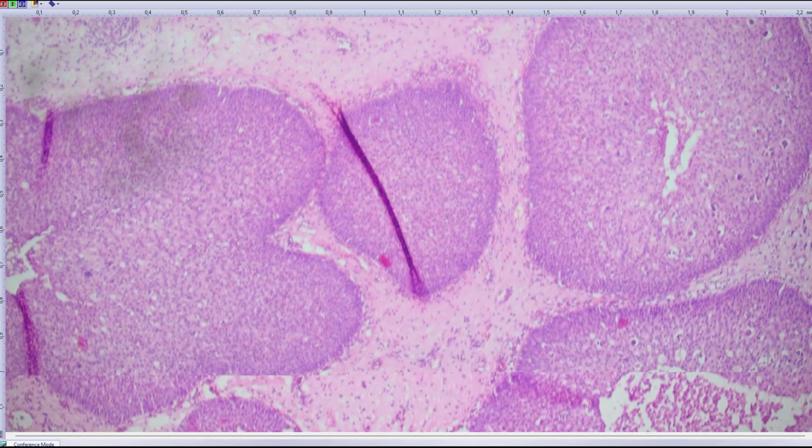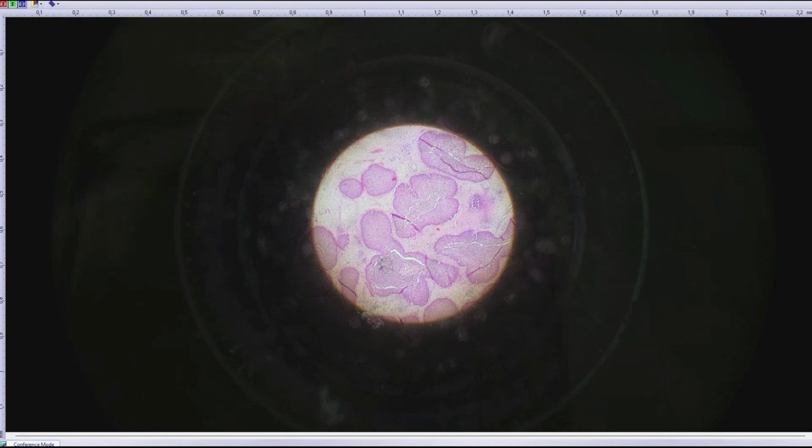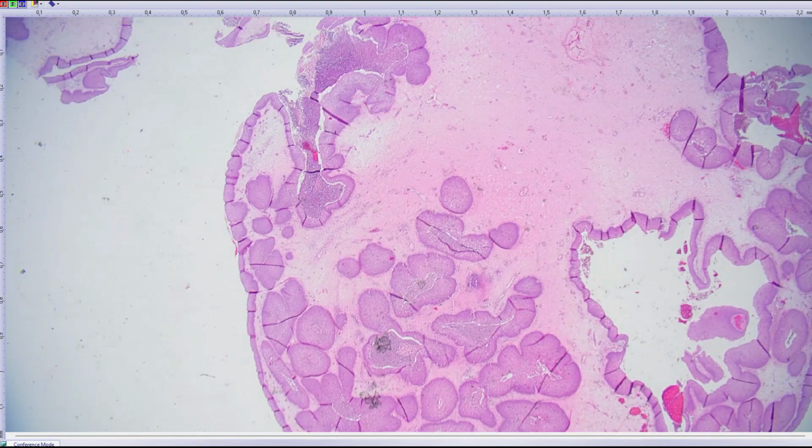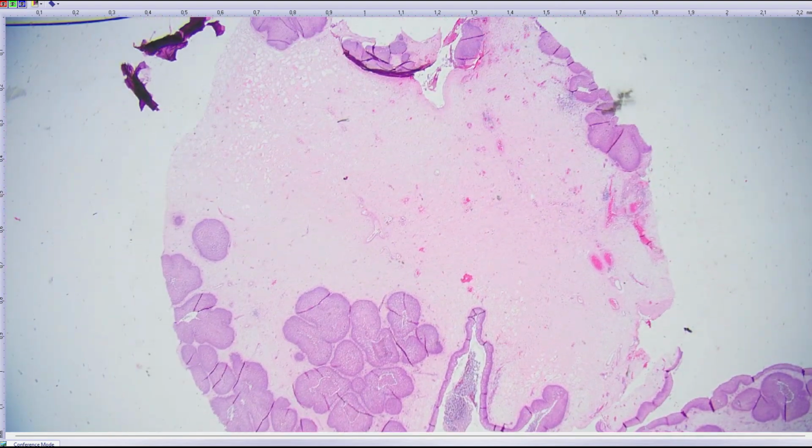I will show you cases in the future, because we are reviewing hundreds of nasal polypoid lesions, and we found that in nasal polypoid lesions there is very little known so far. So I start with this most primitive diagnostic lesion.